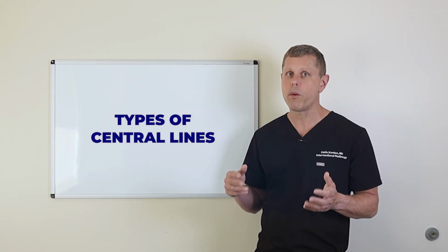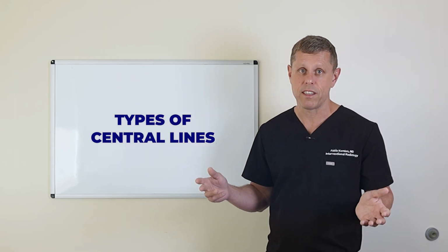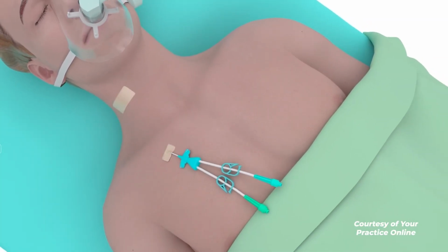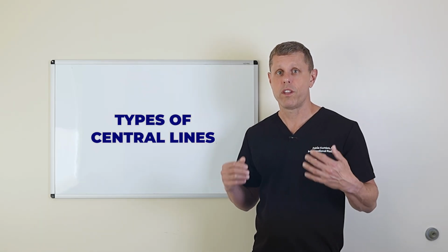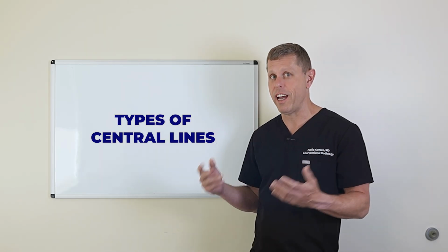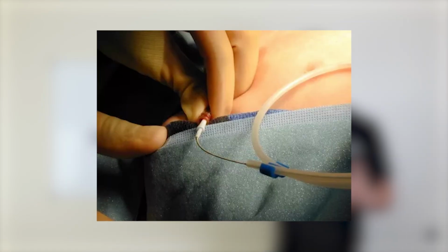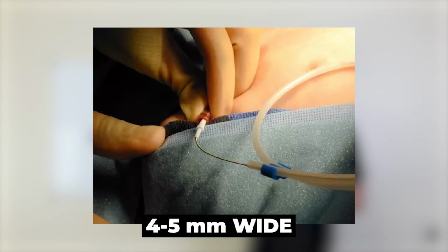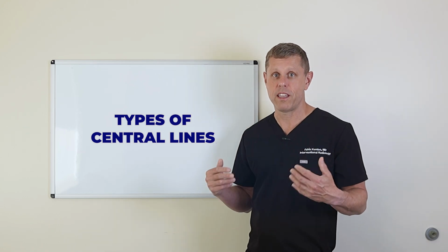Now, the most common use for a tunnel central line is for patients that require dialysis. And they're usually inserted on the chest, and they can be used right away as opposed to a dialysis access that's placed in the arm. So they're the most common form of access for initiating dialysis. The dialysis lines, they tend to be thicker. They are 4 to 5 millimeters wide because, again, you need a lot of blood flow to be able to filtrate the blood in an efficient fashion.